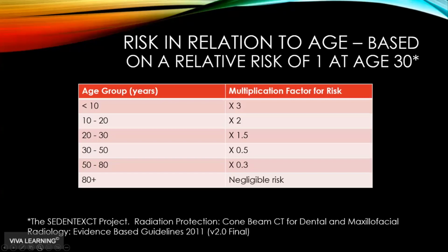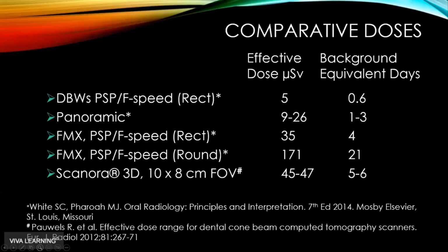And when you get as old as me, you're almost at the point of negligible risk. The likelihood of someone in this age bracket dying from radiation exposure from a CBCT machine is actually negligible. I'm much more likely to die of something else than from radiation exposure. So it's very important to remember this when we think about the pediatric population, and particularly if you're an orthodontist, how many of these CBCTs do you actually want to take on your patient?